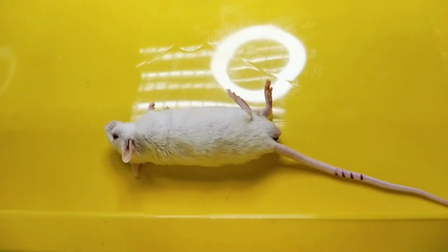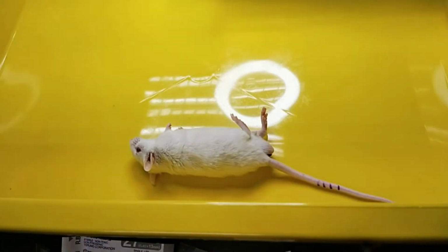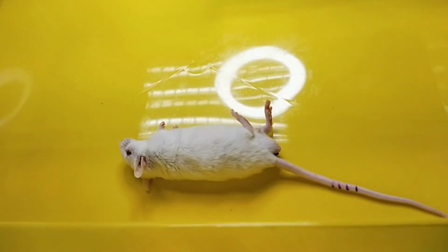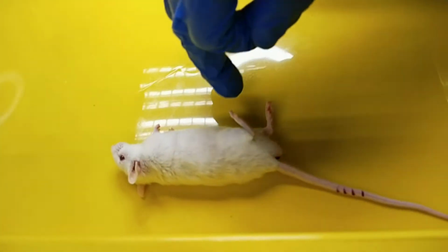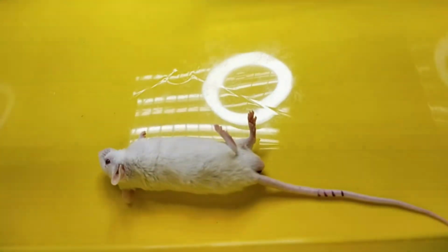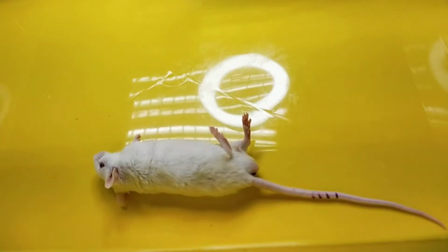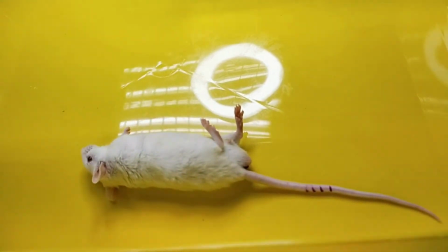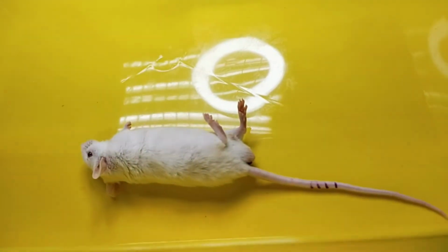So as you can see here, after a few minutes, the animal has already become unconscious. It's already losing their reflex. He's unable to wake up anymore and unable to stand on their feet. So this is the current time, and we need to record the time the animal is losing their reflex.